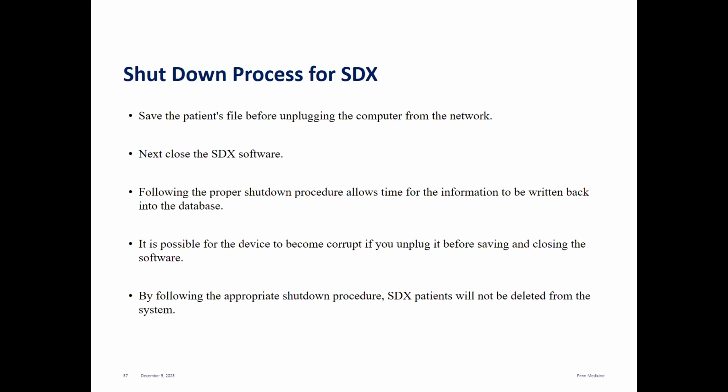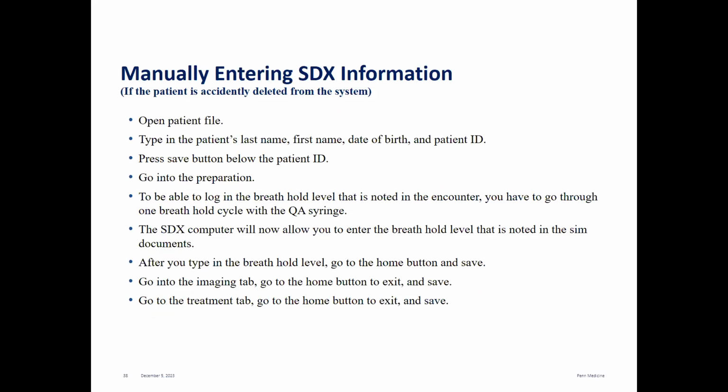So that's why it's important to follow the appropriate shutdown, because if you follow it, the SDX patients will not be deleted from the system. That's real important. If they are deleted from the system, like if the file becomes corrupt, you have to manually enter their information.